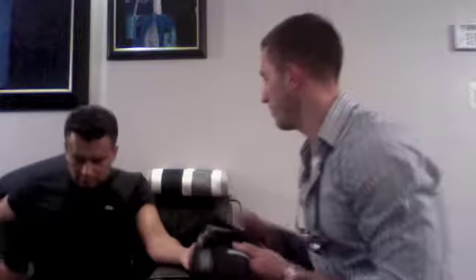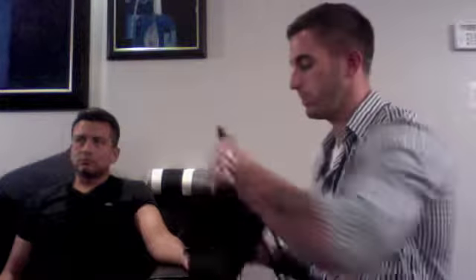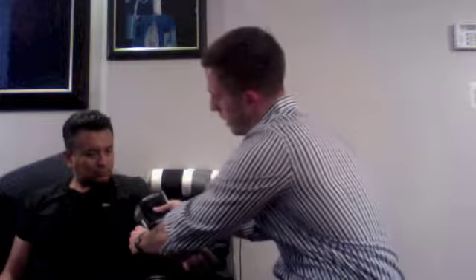Next, you want to make sure you have the right cuff. So first, you want to make sure this covers 40% of his upper arm, which is from his elbow to the top of his shoulder. So that covers 40%, so we're good there. And also, you want to make sure that it wraps around and the Velcro is covered by 80%. So we'll do that as well. It's covered by 80%.